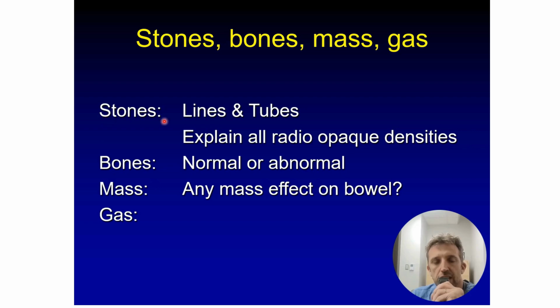So stones, anything radiopaque, always starting with lines and tubes. You've got to explain everything radiopaque. Kidney stones, gallstones, that sort of thing. Bones, normal or abnormal. Mass, is there any mass effect on the bowel? And we'll save the best for last, bowel gas.